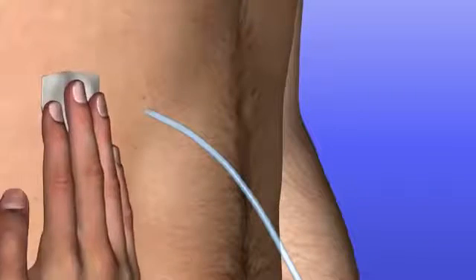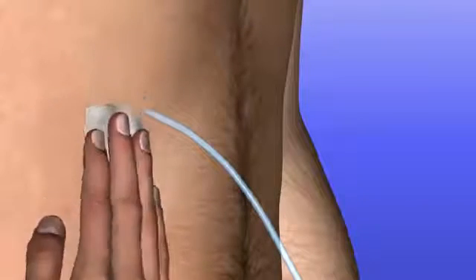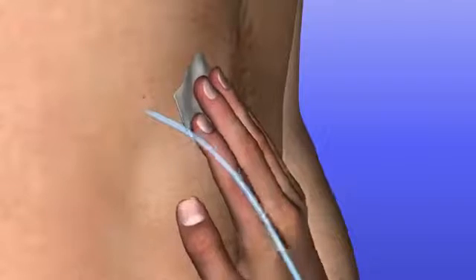Disinfect the area around the catheter exit site with the 2 remaining alcohol pads. Remove and discard the framed center panel of the self-adhesive dressing. Note, the framed center panel is on the opposite of the printed side. Put the dressing back on the blue wrapping.